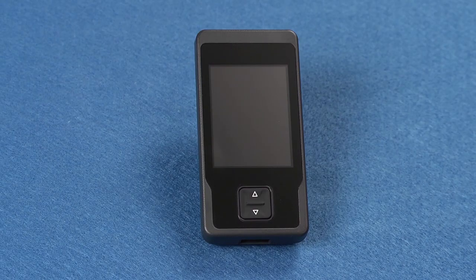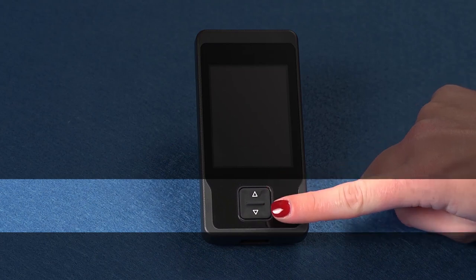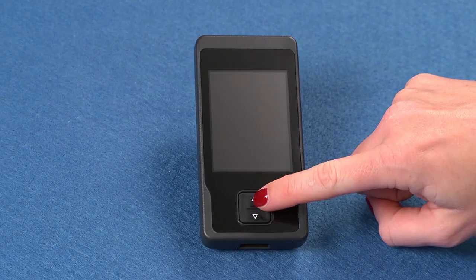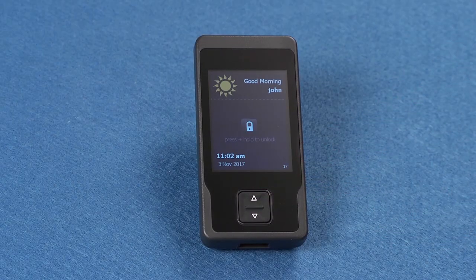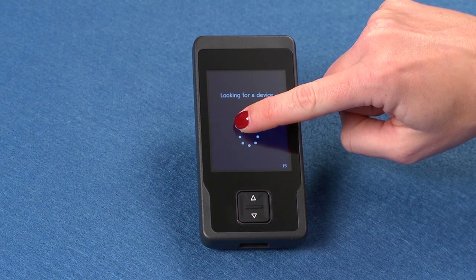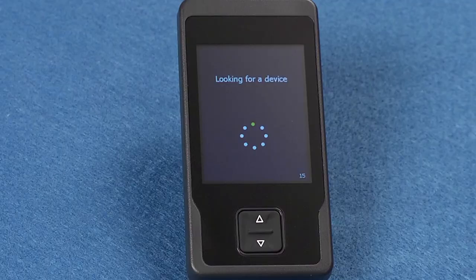First, we will cover the basic programmer functions. To perform most of the functions on the programmer, you must first press the increase-decrease key to wake up the programmer. When the increase-decrease key is pressed to wake up the programmer, the unlock screen appears. Press and hold the lock button on the lock screen. Stop pressing the lock button when the screen changes to a circle of dots. This indicates that the programmer is searching for your neurostimulator and unlocking.